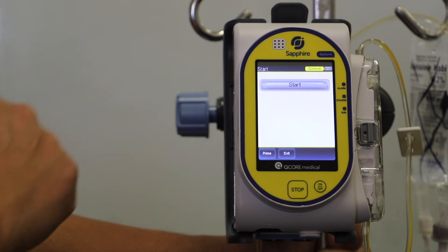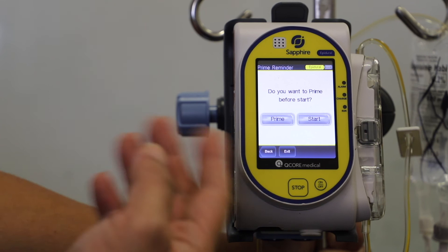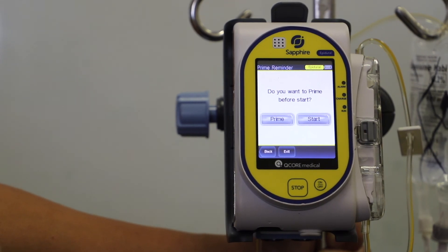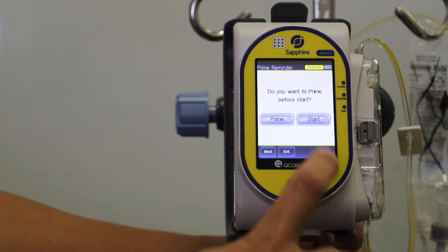Then you press start, making sure it is connected to the patient. It prompts you, would you like to prime before we start? We don't need to, as it's already previously been primed, so we can press start.